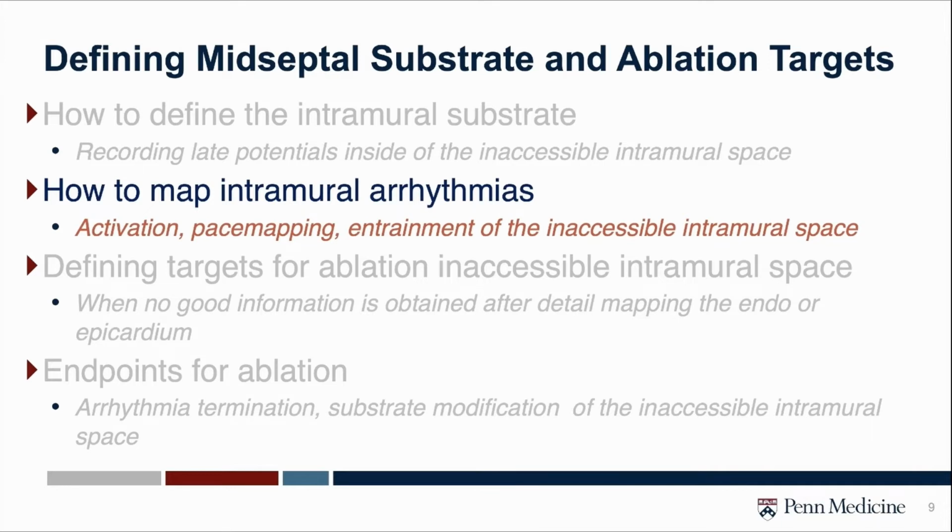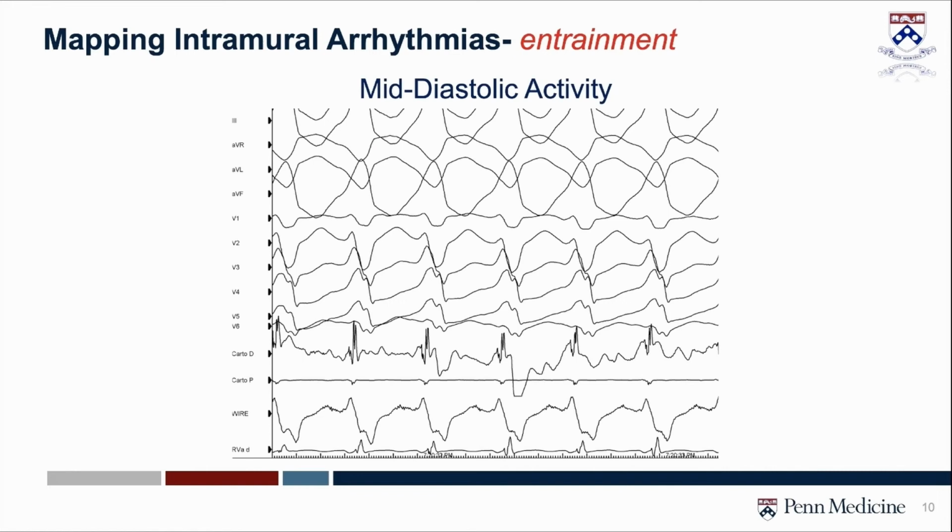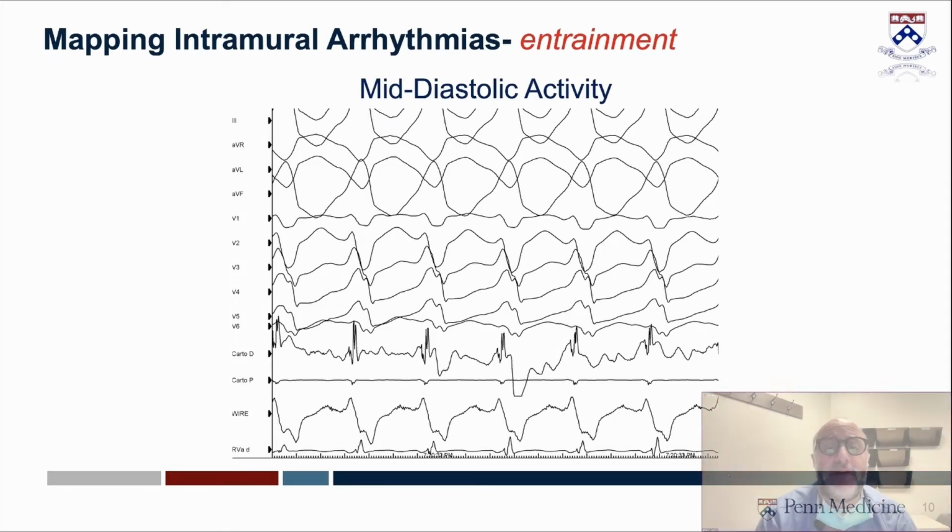So I have examples here that prove the utility of a unipolar wire for mapping sustained ventricular tachycardia. This is a patient with septal substrate and inferiorly directed VT that most people would think is exiting, and probably is on the RV side of the outflow tract, but we couldn't find any early activation in the endocardium.